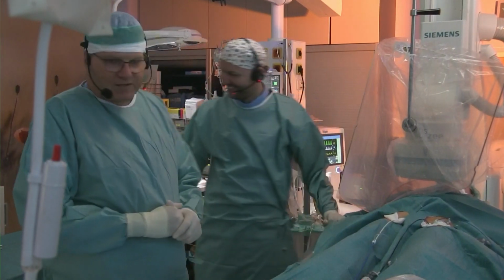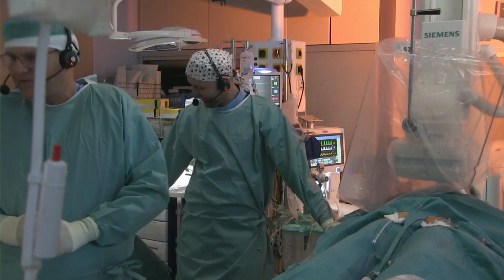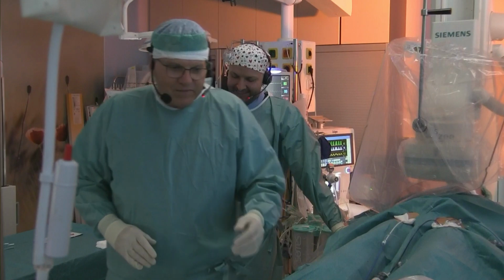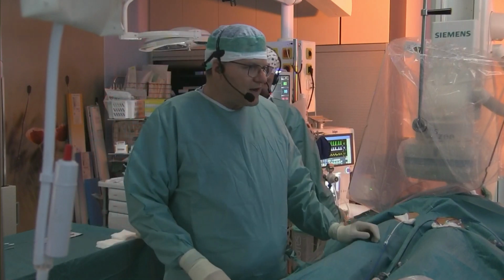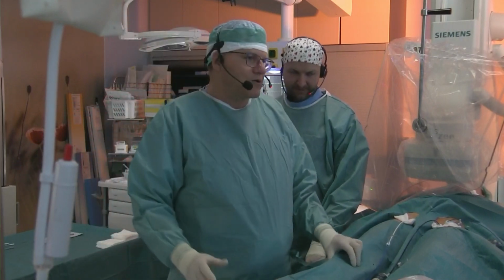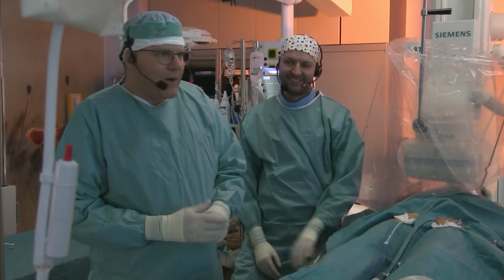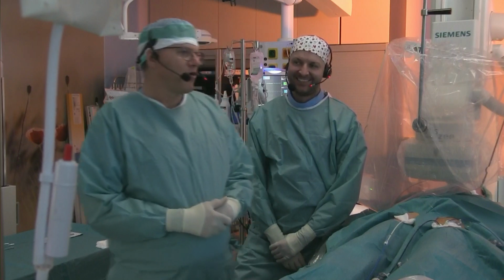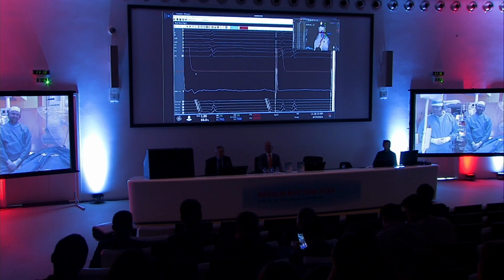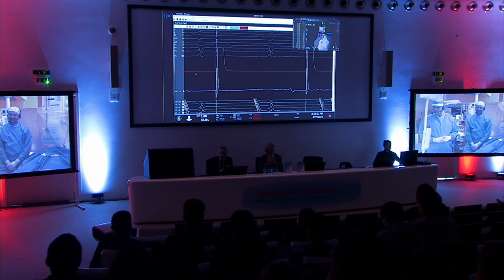If I remember well, it was not reported in AF. There were only a few phrenic lesions, but all of these were temporary, disappearing within 1 hour, 2 hours, or up to 1 day. So hopefully it will be the same in this case. Okay. Thank you very much.